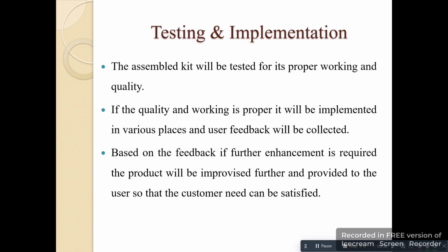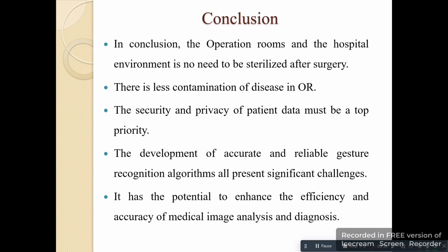Based on the feedback, if further enhancement is required, the product will be improvised further and provided to the user so that the customer need can be satisfied. Conclusion. In conclusion, the operating rooms and the hospital environment need not be sterilized after surgery. That means less contamination of disease in the OR.